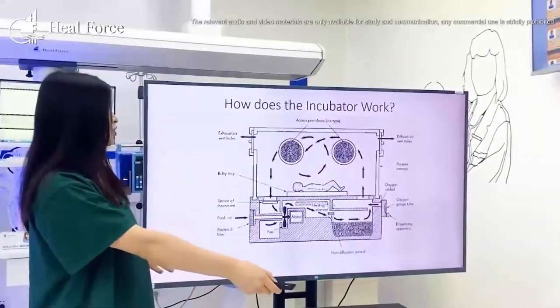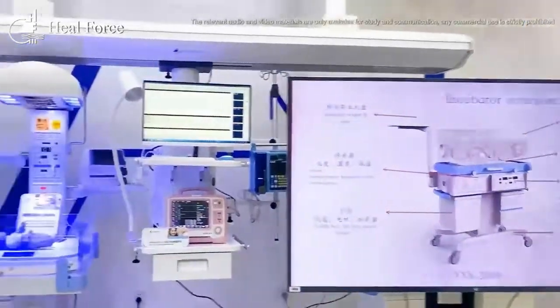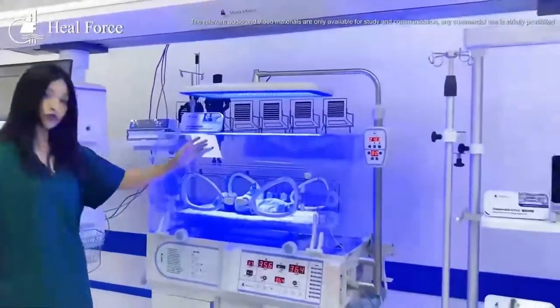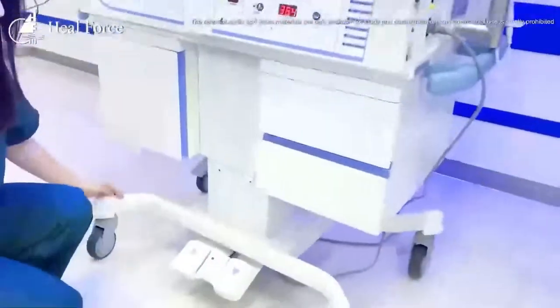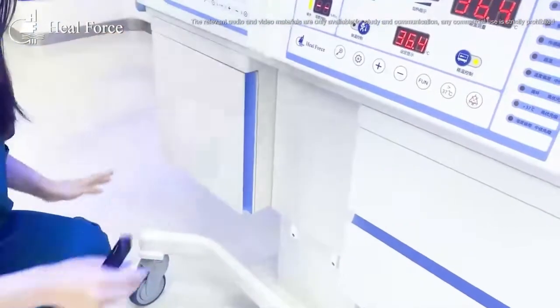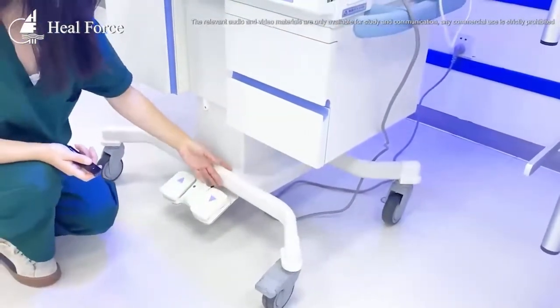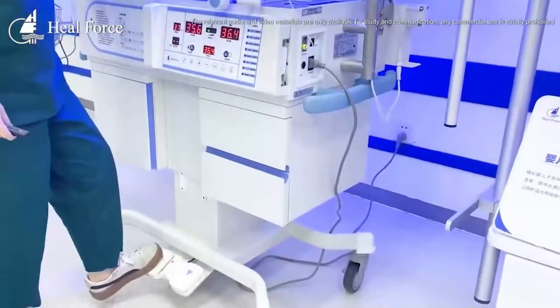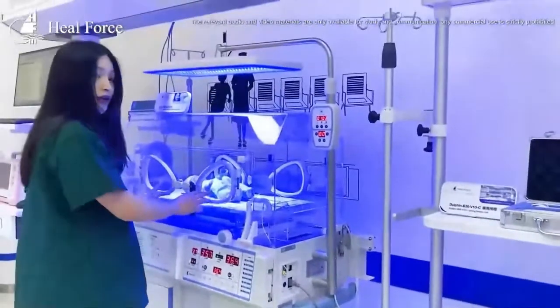Now let me introduce one of our incubators. I would like to introduce it from the bottom to the top. The first thing you can see is that we designed wheels — casters — so that nurses can move the machine easily. The machine base is also designed so that it is very easy for nurses to clean. We also designed an electronic lifting function so nurses can operate with the baby at the proper height.